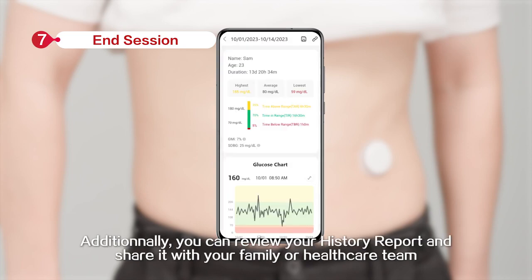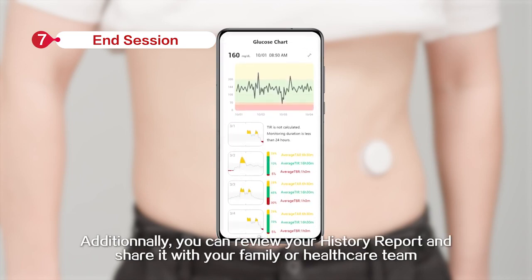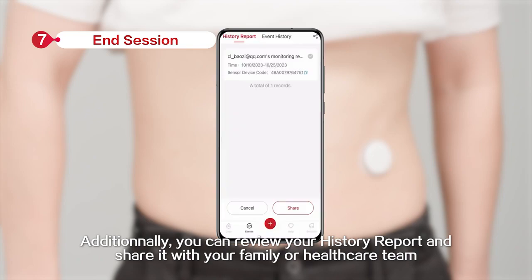In the app, you can click Change New Sensor to scan and start a new CGM. Additionally, you can review your history report and share it with your family or healthcare team.